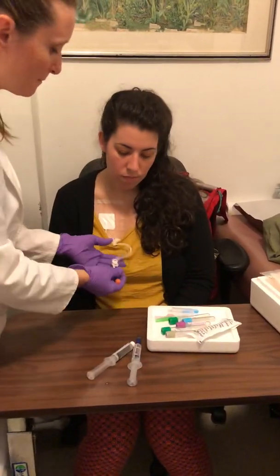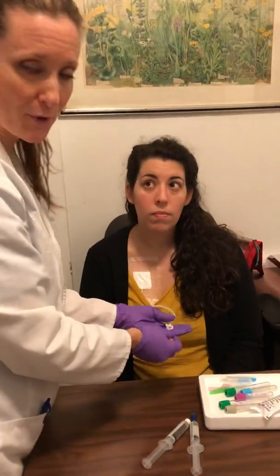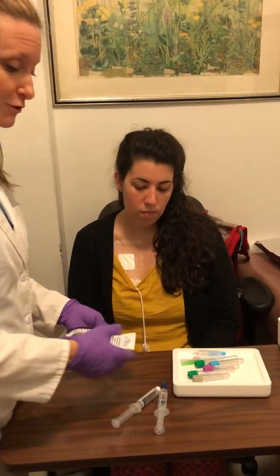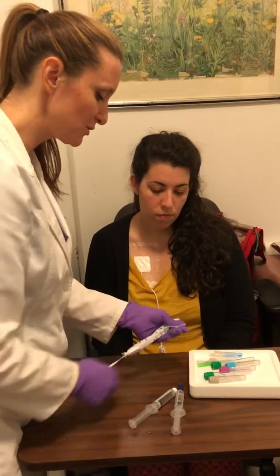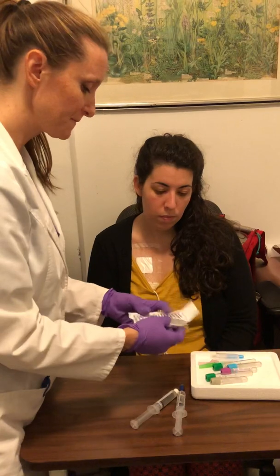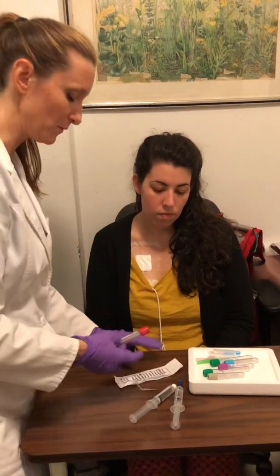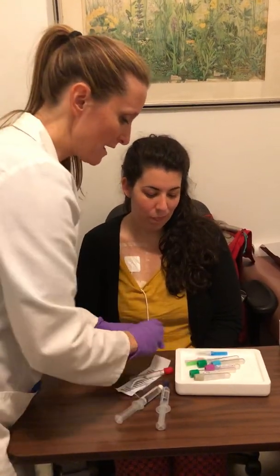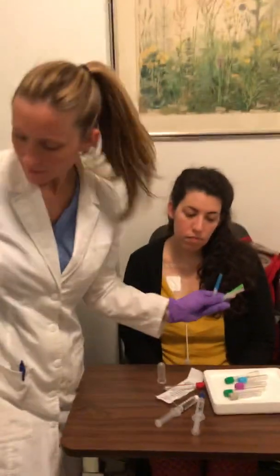Since you're drawing from a Hickman line, Hickman's are heparinized when they're not being utilized so they don't clot. The first thing you have to do is draw a waste tube. The label on it says this should not be used to collect a specimen — this is your waste tube. Draw the red blood and throw it away.